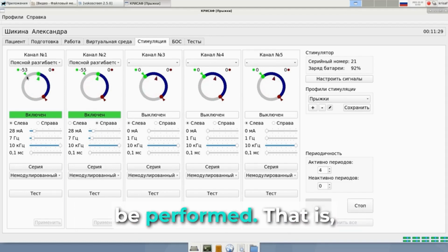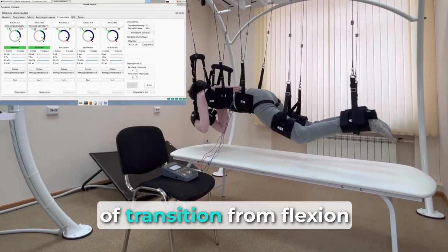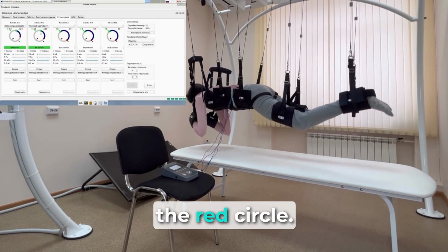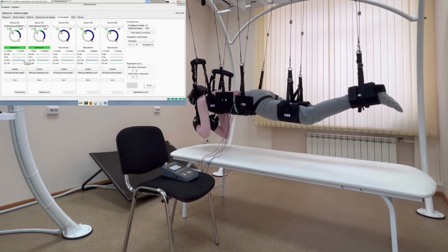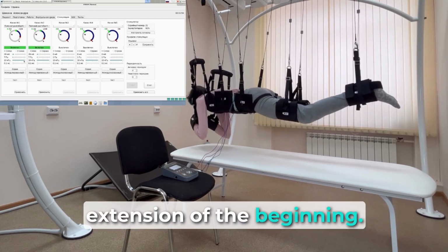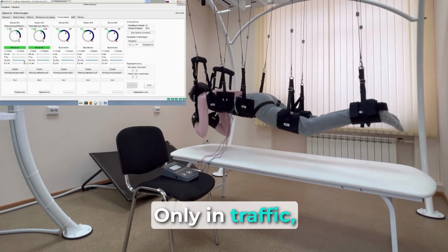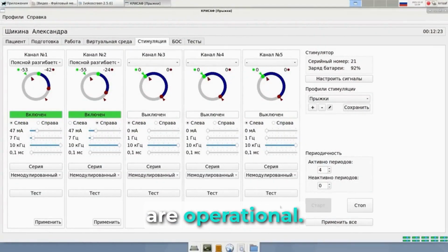The blue part of the arc is the time when stimulation will be performed. That is, we move the beginning of stimulation away from the point of transition from flexion to extension, and we also shift the end of stimulation by moving the red circle. That is, we carry out stimulation somewhere in the middle between the points of flexion and extension. Only in movement, the stimulator display shows green during stimulation. The first and second channels are operational.